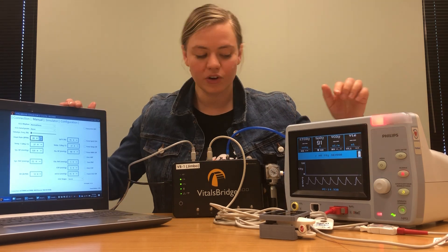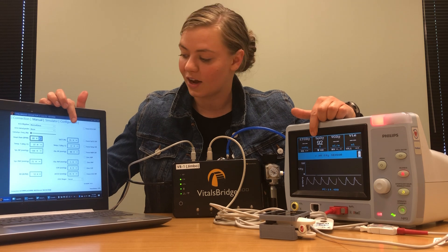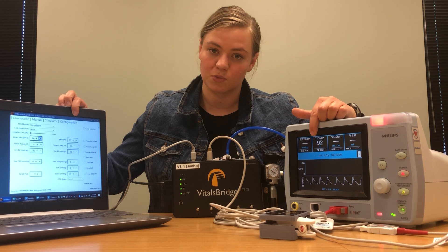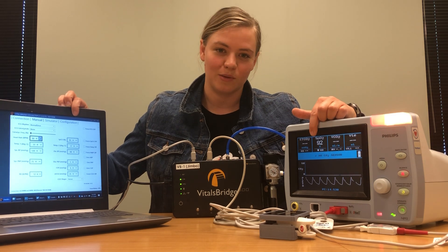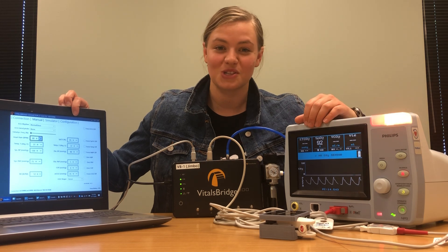If your patient monitor reading on your SpO2 is not the same thing as what you've put in your VitalsBridge connector software, that's really easy to fix. Just come to the configuration tab of the VitalsBridge software and run a calibration. Instructions for running the calibration can be found on vitalsbridge.com.